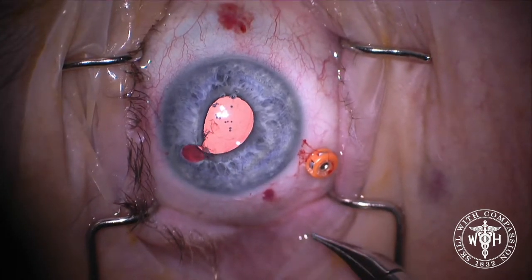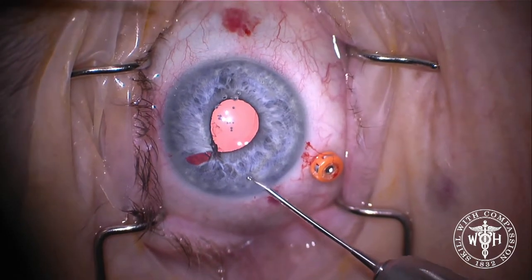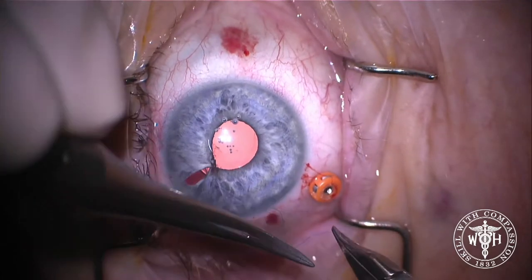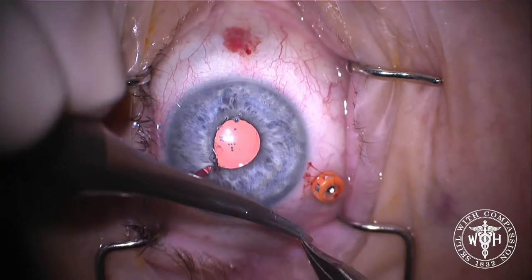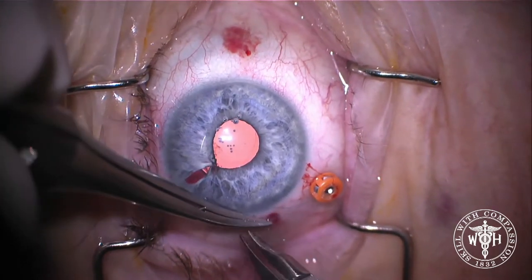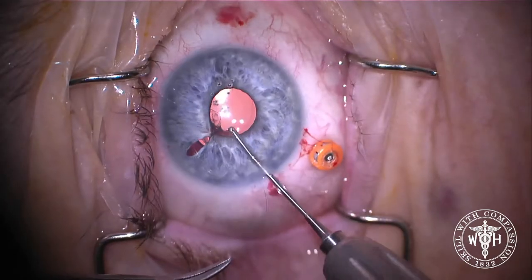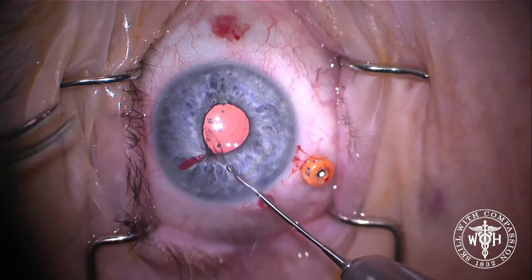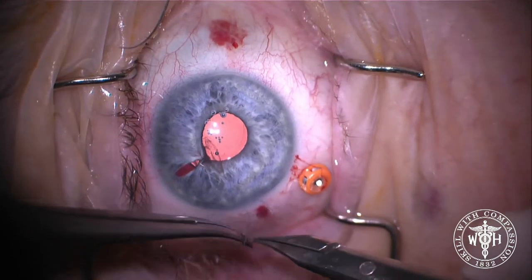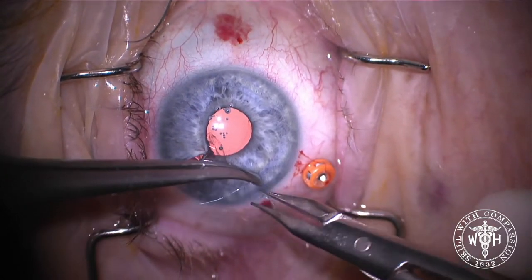So first, we're going to bring together the pupil border. Each one of these sutures is a 2-1-1. So you'll have to go back and recover that distal end of the suture — that little loop that you pull out of the eye twice. The first time, I wrap the suture around twice, and then the next two times it's just a single wrap. Then you pull both free ends of the suture, and that will essentially slide the knot into the eye. I have another YouTube video on this technique using a paper plate model, and it really shows the technique quite easily.